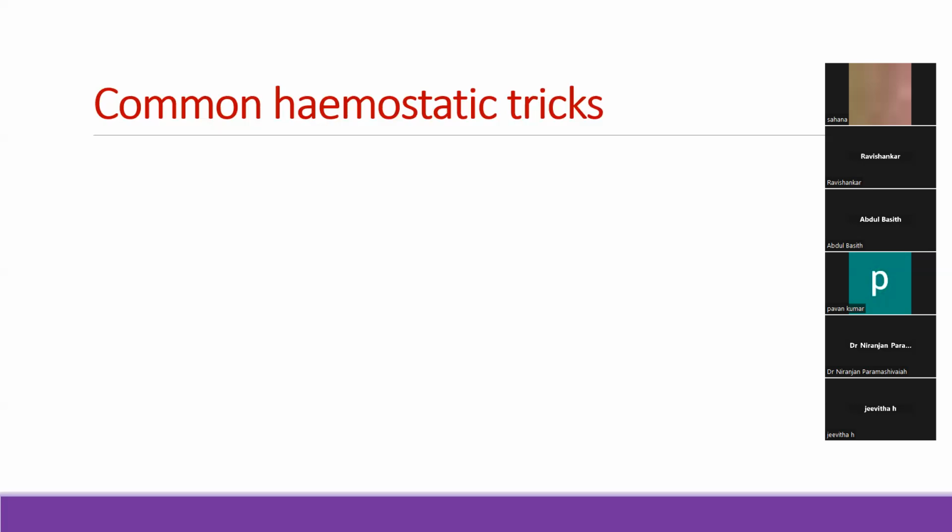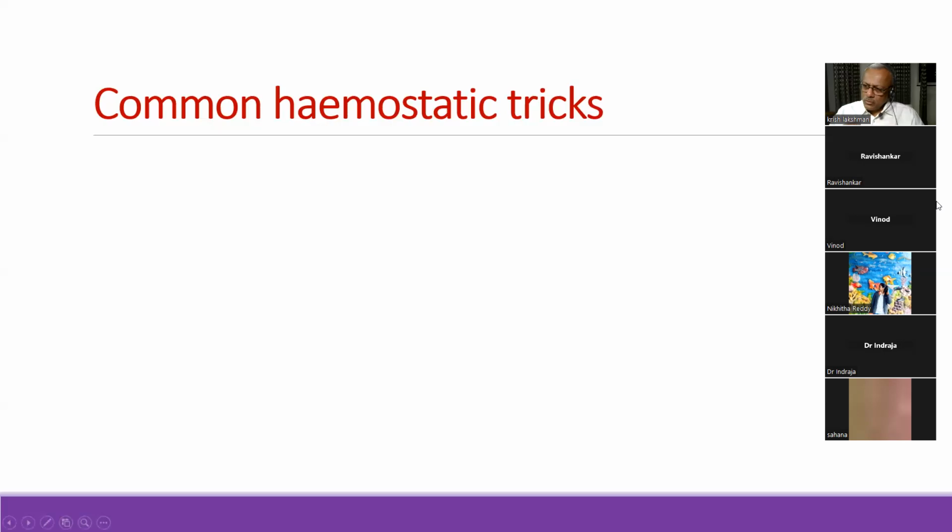port. Yes, but the thing to do is to make it into smaller pieces, not the standard size gauze piece, and wrap it up or roll it up so that it fits into a reducer and then push it in. Yes, sir. And don't have more than one gauze piece at a time. That's the principle I use. Use it for pressure, and once the job is done, take it out until you put the next one in if required. So apart from the gauze piece, what else would you use?